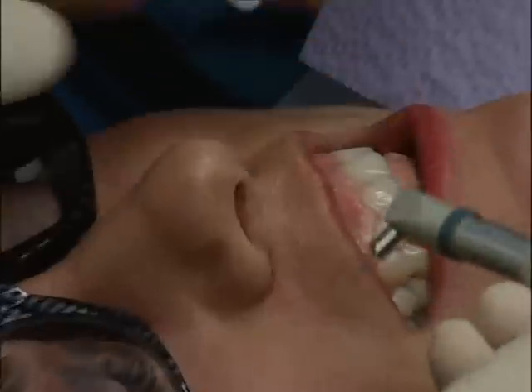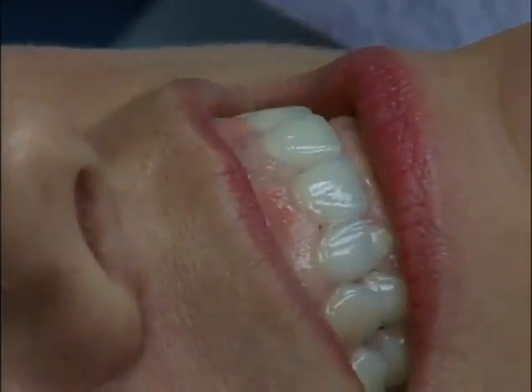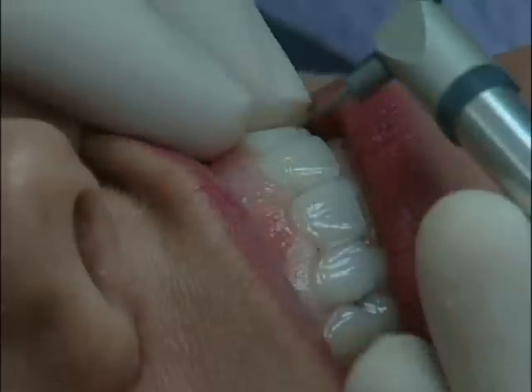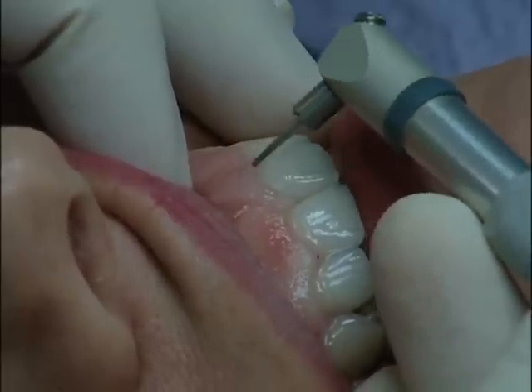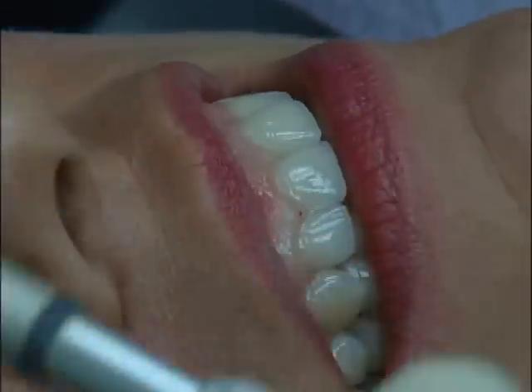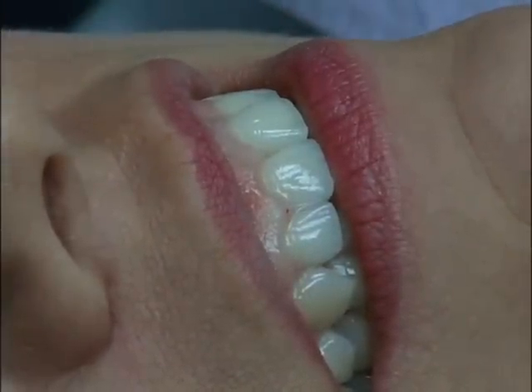Okay, so what I'm going to do here is I'm going to actually try to do two things. The first thing I'm going to do is even up the tissue from 8 to 9. The second thing is I see just a little bit of irritation up in here, and I'm just going to go through and laser the outside and the inside of this pocket around the implant, just in case I can enhance if there's anything going on there.